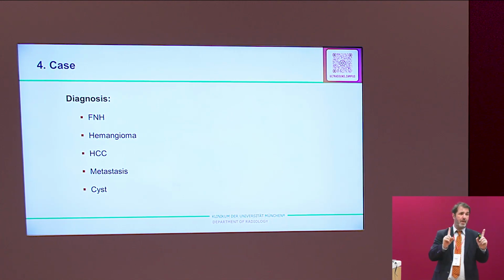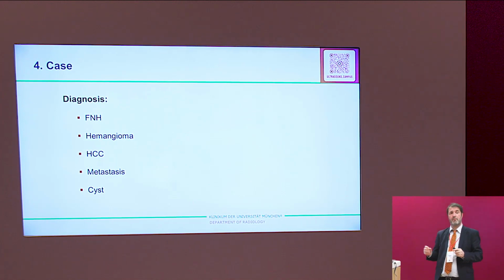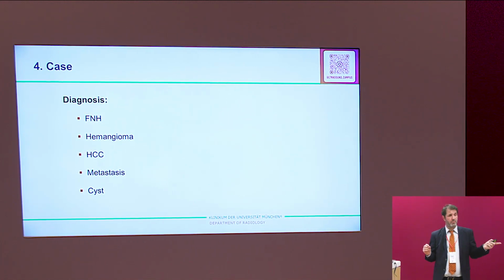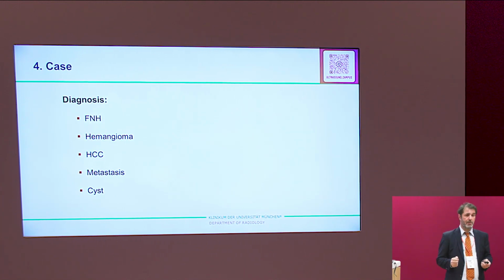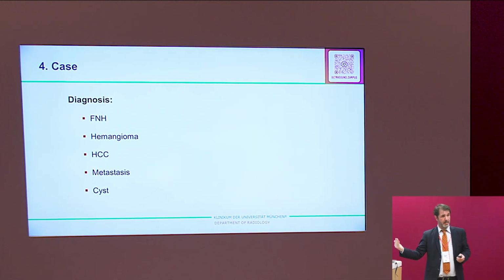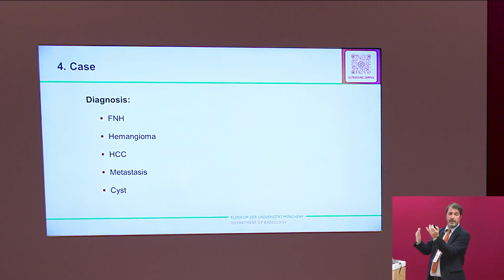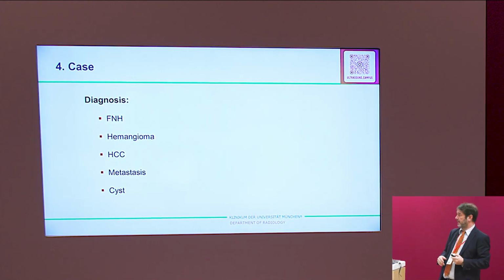But you see, the plane, that's important, matches perfectly. And sometimes it's very tricky to find tiny lesions which they describe in the CT, a sub-centimeter lesion, and tell us what kind of lesion it is. Then you have to scan a half hour to find this lesion, and at the end of your examination, they said, are you sure that you have seen the correct lesion? But by fusion, you know exactly what the target lesion is, and the other doctor, who sent the patient to you, sees, okay, he has really done this lesion and nothing else.